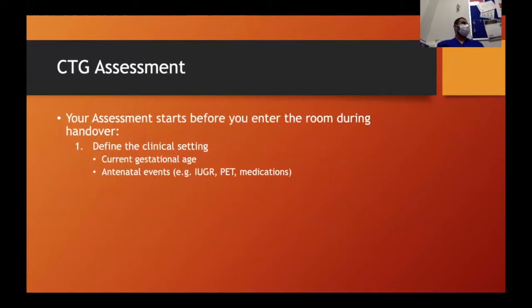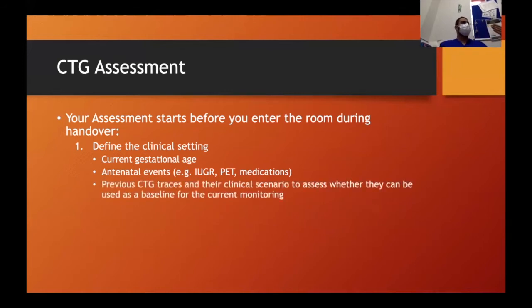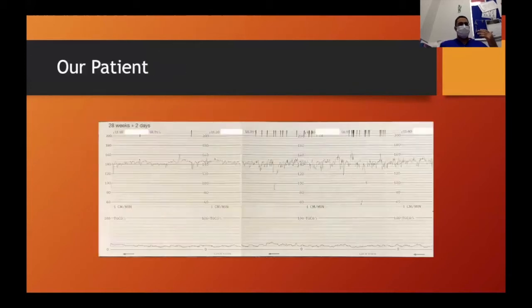What do we do after that? So on a ward round, on a day, we've just had the handover in front of the board. What do we do after that? Go to the room, see the woman, talk to the midwife before you go in. So you knock on the door, she brings the notes out, we have a look through the notes. The idea is to look at her previous assessments for ourselves. We need to figure out what this baby's monitoring has been, what its norms are, and we set up the norms. So this is what it was in the past.